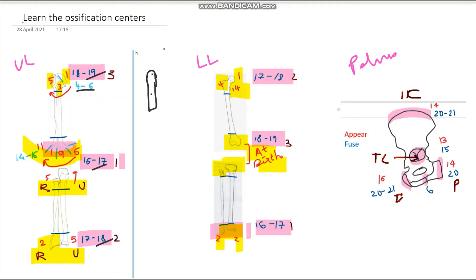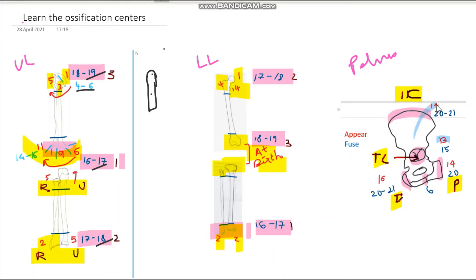Now let's come to the pelvis. For the pelvis we need to memorize the appearance of the iliac crest, pubis, ischium, the tri-radiate cartilage, and the fusion of the ischiopubic rami. First comes the tri-radiate cartilage — 'tri' sounds like 13, so the tri-radiate cartilage appears at 13 years of age. Then going clockwise you reach the iliac crest.